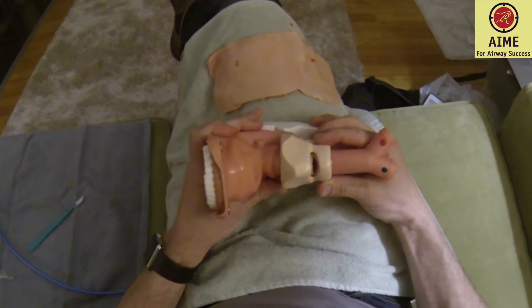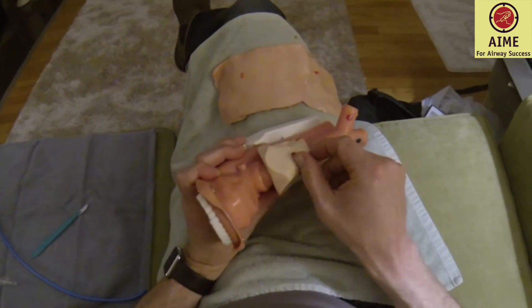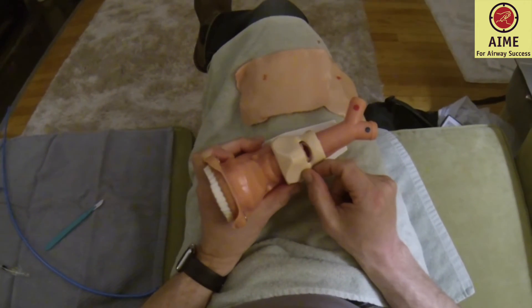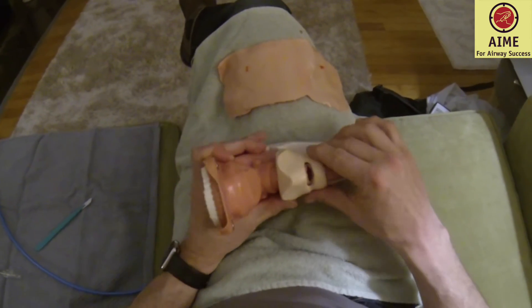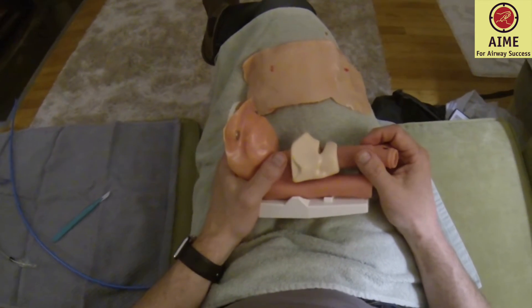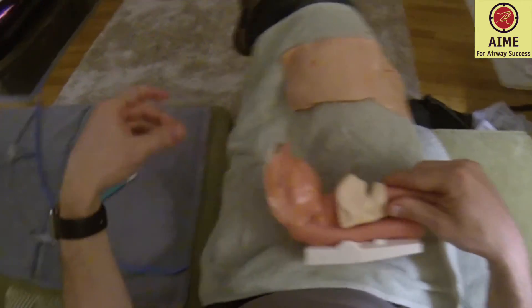The cricothyroid membrane, as Rich Levin talks about, was really designed for us to enter with a sharp device. You have the cricoid cartilage below, the thyroid cartilage above, and they overlap laterally — the cricoid cartilage is there posteriorly. So it's really hard to go wrong in terms of causing damage when placing your blade, and that gives us comfort.